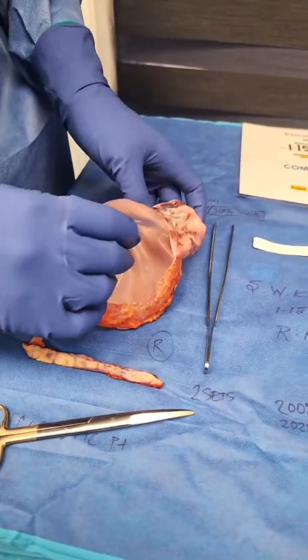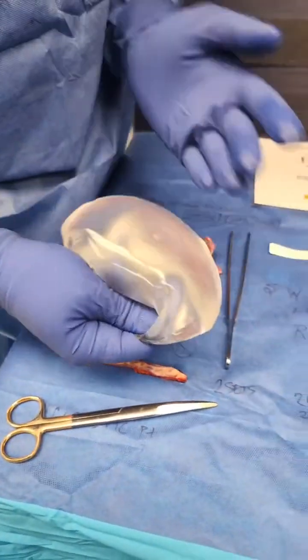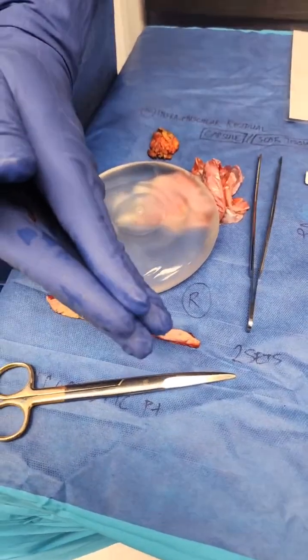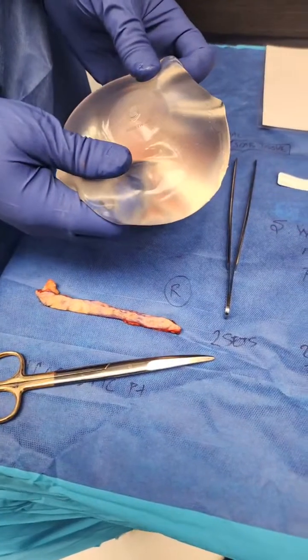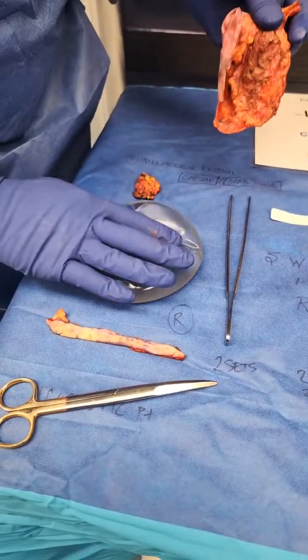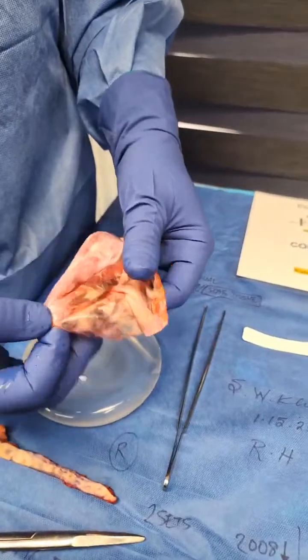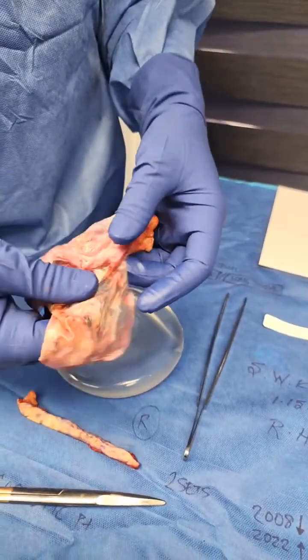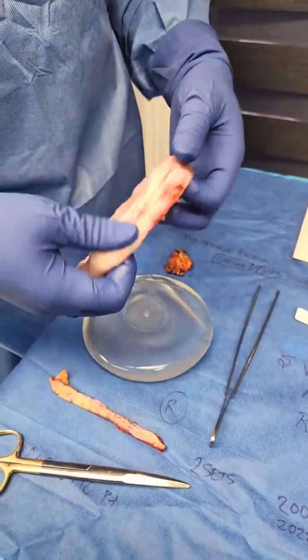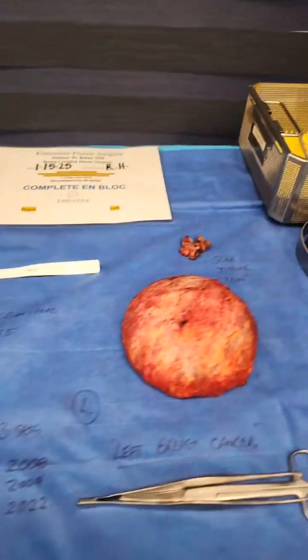Remember, the surgery is all about precision and not about speed. And as I go in, there's some fluid around. You can see that stickiness. This is your gel bleed. This is your Mentor 340cc implant. And what I would say, brand new condition. And as you will see right here, you have relatively very thin capsular tissue. And overall, I'm very happy, content with how the whole dissection has gone. So the right side was treated as a cosmetic patient.